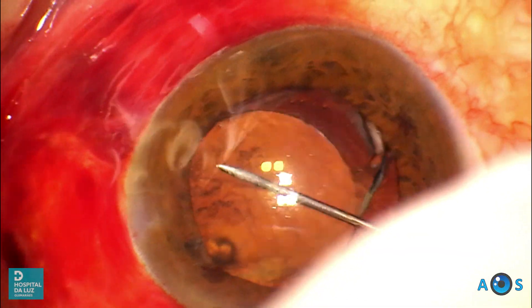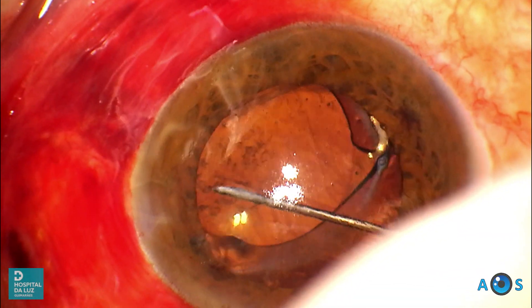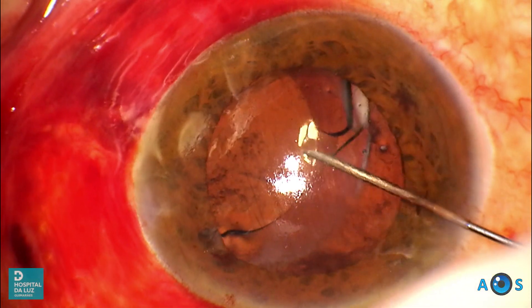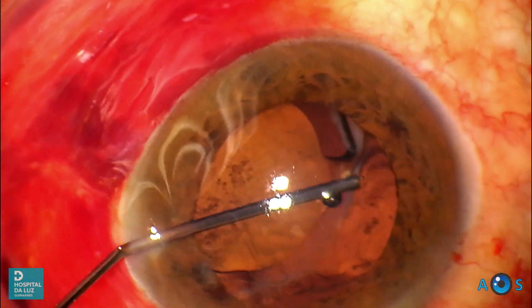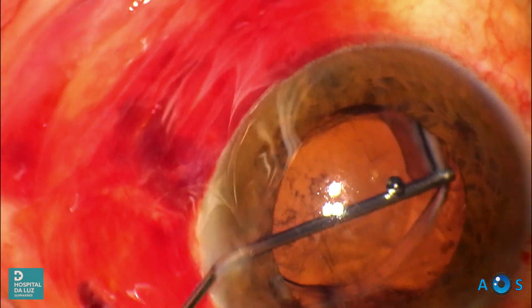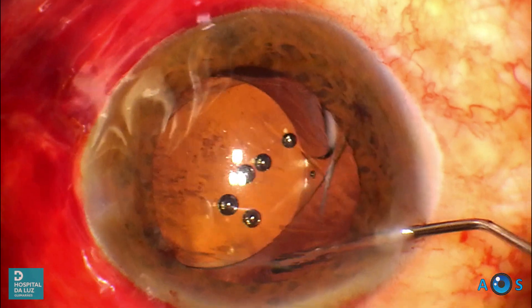The process is repeated on the nasal side of the lens. It is readily apparent that the nasal side and haptic are more mobile. So we go back to further releasing the temporal haptic, and soon a viscoelastic wave is seen progressing behind the IOL, indicating that the capsular sheets have been separated and the bag is now open.